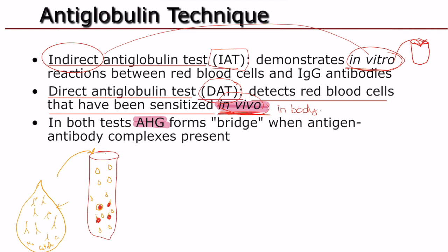But now we also know when this happens, that IgG is so small, it doesn't cause that direct linking or lattice formation. So we can't see it because the IgG is so small. These are IgG. Remember, our IgM are really good at it, and they lead to that direct agglutination.